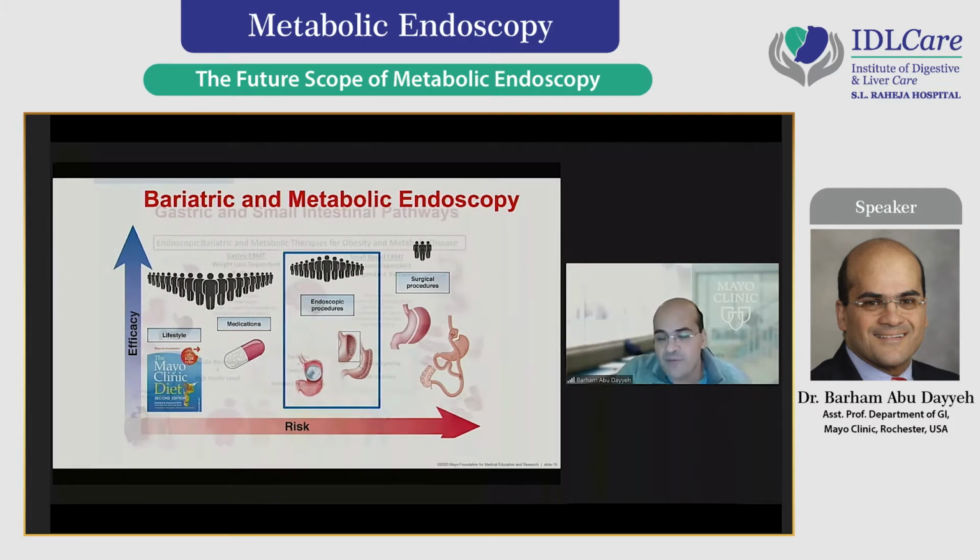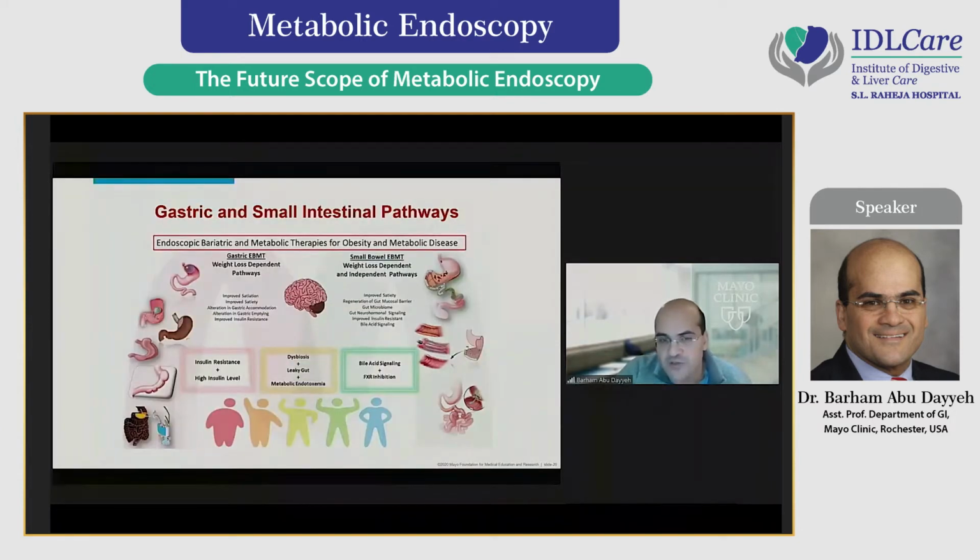I'm not going to belabor all these devices because I would like to focus on the future and advancement, but suffice to say, we have devices that target the stomach, and their main endpoint is to improve satiety, satiation, alter the accommodation and emptying of the stomach, to improve weight, to produce weight loss dependent improvement in insulin resistance.